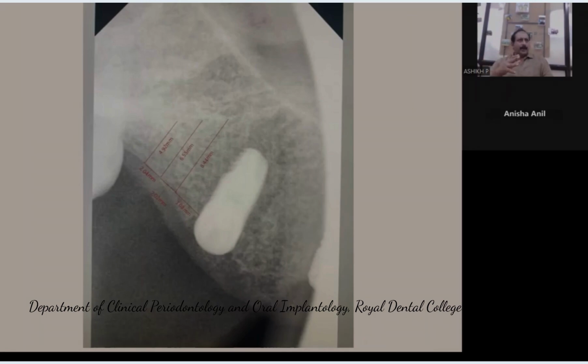So you have got your split master with you, with which you can expand it very slowly. You shouldn't be going too fast. Do it very slowly because bone should be given some time for its kneading as well. It can be manipulated very slowly. If you go faster, the bone won't get time to expand as such. It will be cracking. So with that split master, if you're going in for an expansion, do it very slowly.